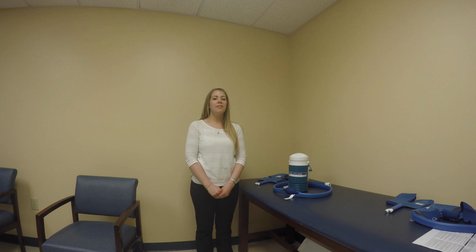Today we'll walk you through how to use this unit, but it's always important to review the warranty and caution information in the packet for the unit prior to using this device. It is important to use the unit only as prescribed by a licensed healthcare professional.